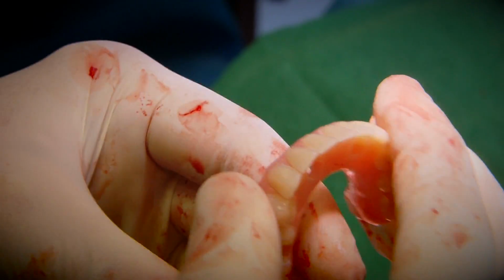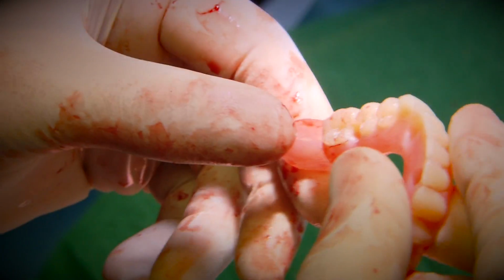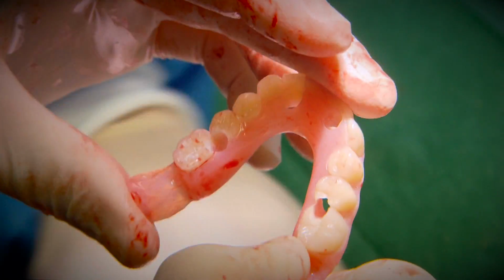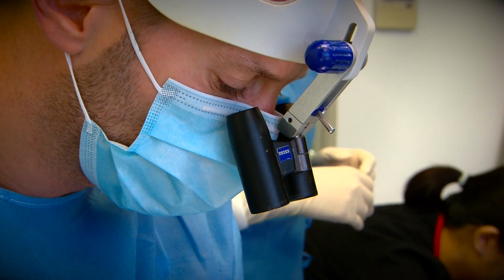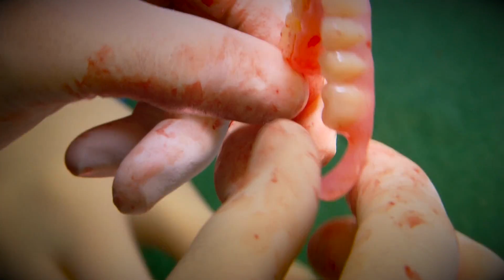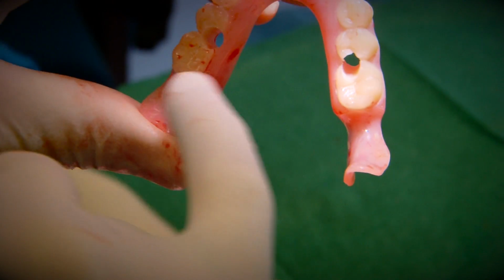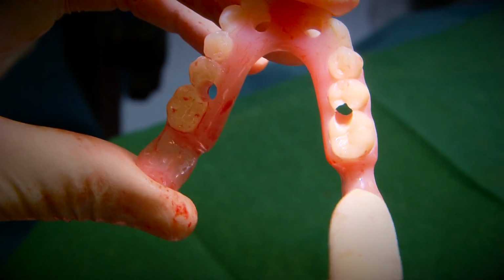These are the teeth, and the teeth have been set up according to a discussion we've had about colour, shape, and how far the jaws have to be apart, or how open the bite has to be. After we've done that, the technician makes this, and he puts the teeth that we're going to use later on the real bridge on a surgical guide. When we say a surgical guide, it's something that seats back here. Now back here is important because we haven't touched that. It's not part of the alveolectomy, not part of the procedure.